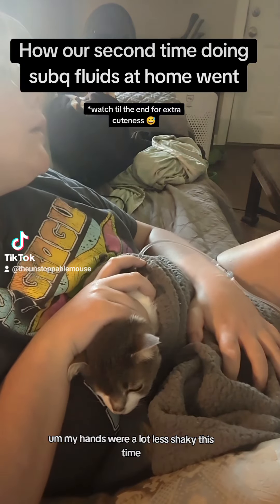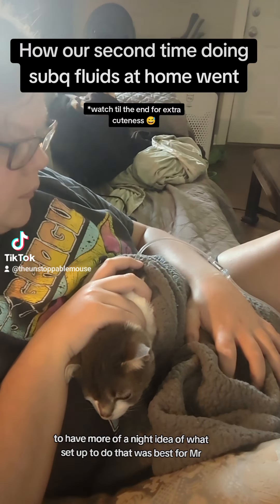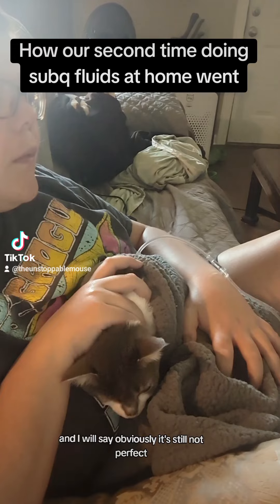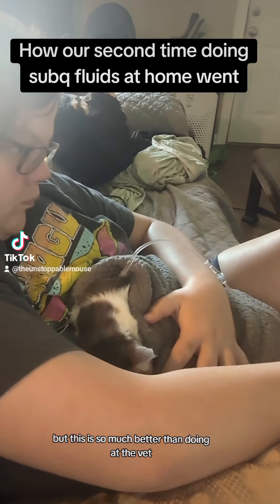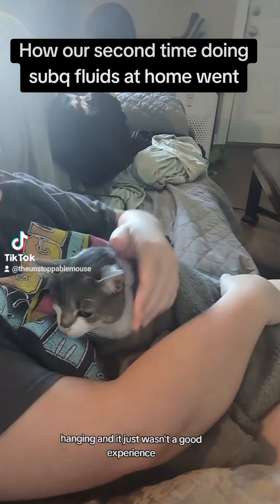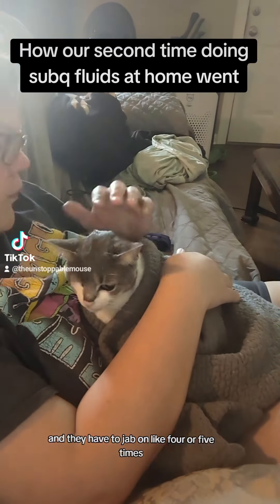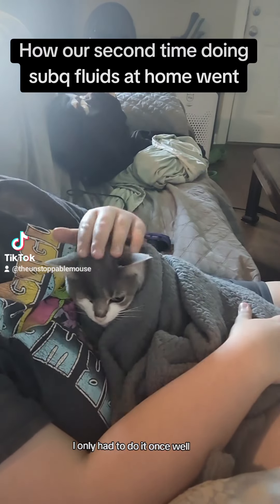My hands were a lot less shaky this time, so that was nice. I had more of an idea of what setup worked best for Mr. Mouse because he is wild. It's still not perfect, but this is so much better than doing it at the vet — they scruffed him really hard and had him hanging, and had to jab him four or five times — whereas at home in a stress-free environment I only had to do it once.